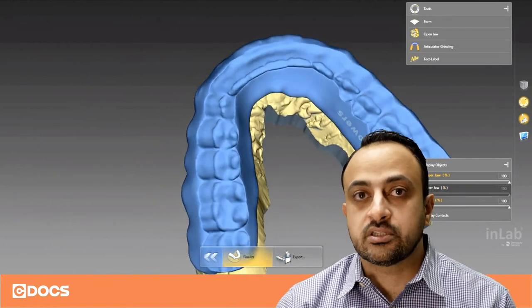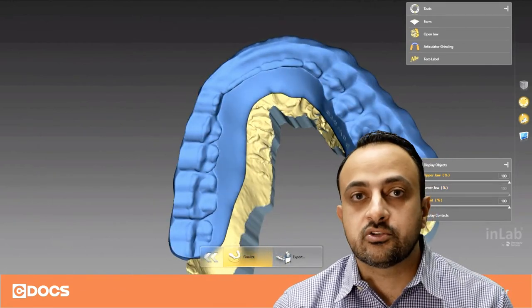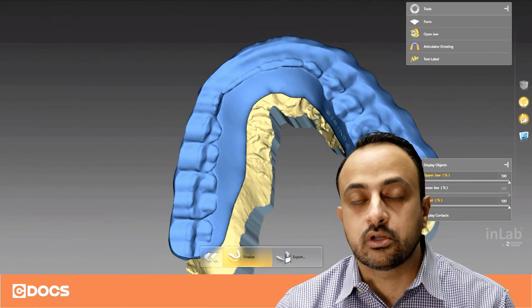When I go and export this splint and send it to the printer, as soon as I deliver this, there'll be very minimal or almost no occlusal adjustments whatsoever.